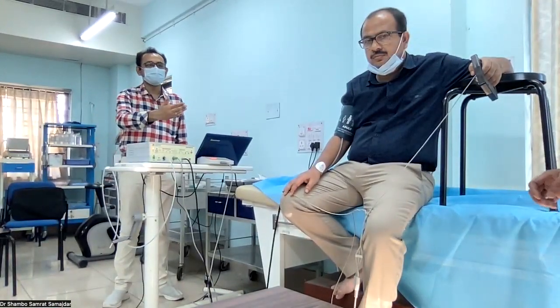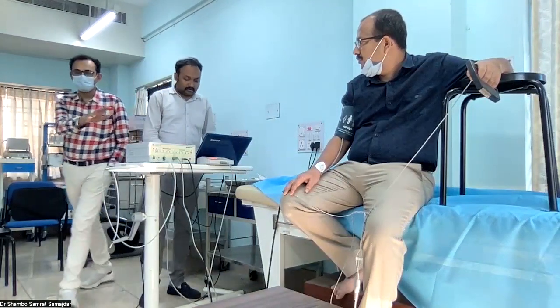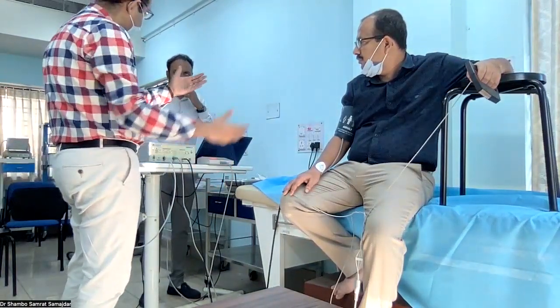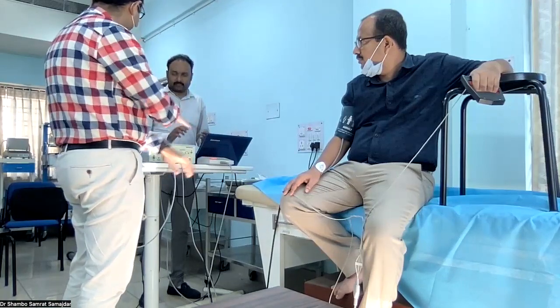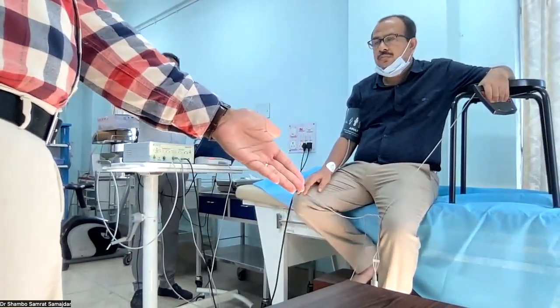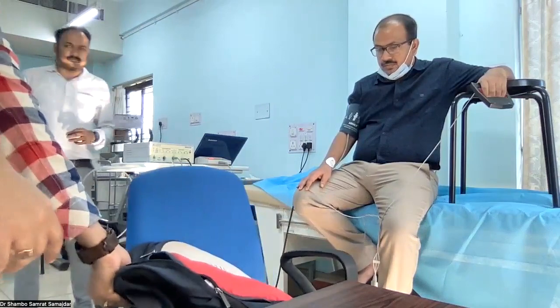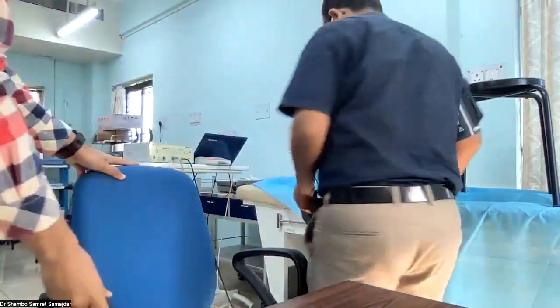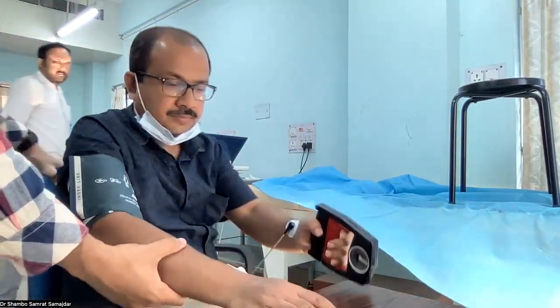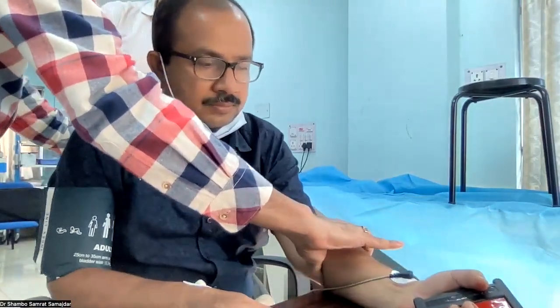This is a little unphysiological, but okay, we can do that. Otherwise, we can ask the patient to lie down, and they can also squeeze. The only thing is that the hand should be in the resting position. This position is a little difficult. So you can come and sit here. Yes, and you can keep it in the resting position. The elbow should be rested properly.